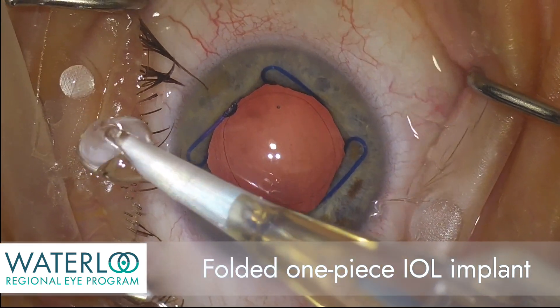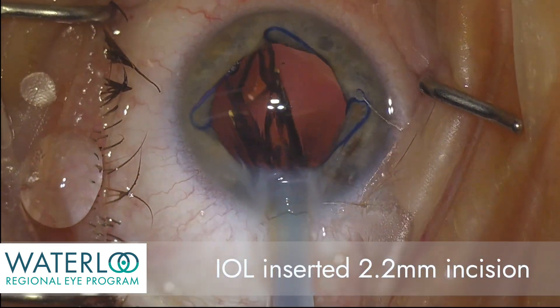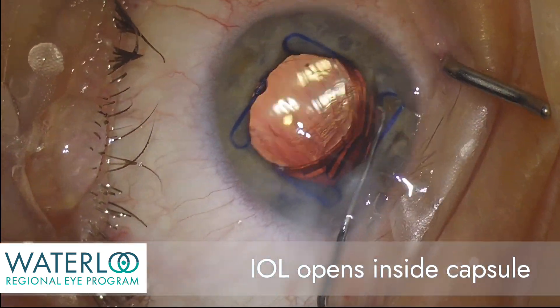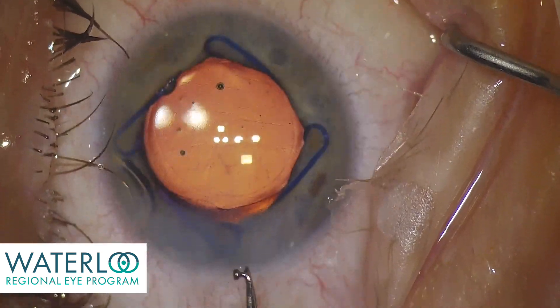A folded one-piece IOL implant is now inserted through the 2.2 millimeter incision. The implant unfolds and opens inside the capsule — the natural support system of the eye — that will keep the implant centered in place.